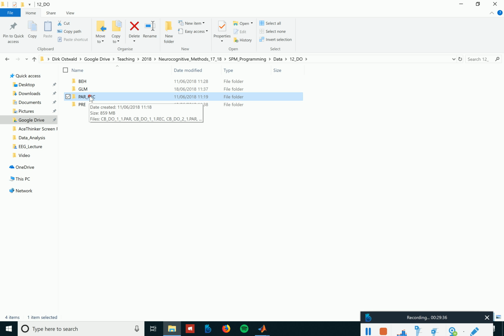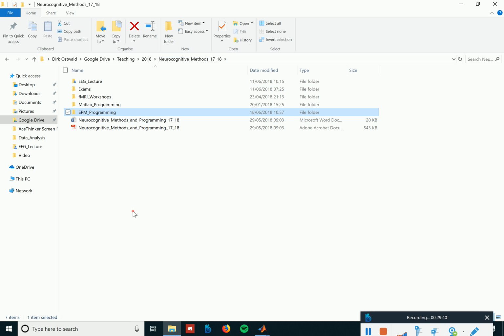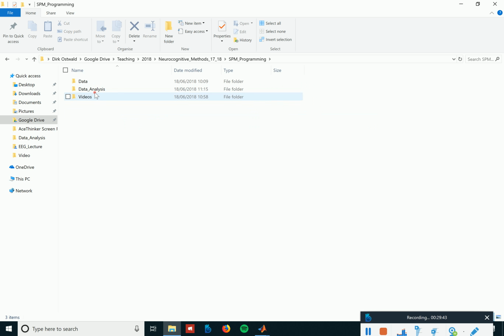They will be somewhere else, and the data analysis would then use the data from there. That's how BIDS wants the raw data separate from the derivatives. This is easily adapted later on, and currently we have the parec in here.